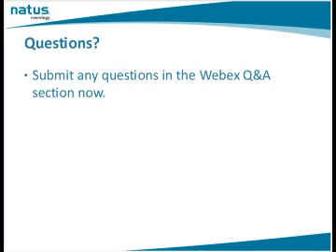So just to review, you want a minimum of 2 pictures of the MCA, 2 pictures of the ACA. That can be at the bifurcation and about 6 millimeters deeper, or also at the midline. You want a minimum of 1 or 2 pictures of the PCA, 1 picture of the terminal, et cetera. So I hope that's answered the question. If it hasn't, please feel free to either clarify it now or to email us.